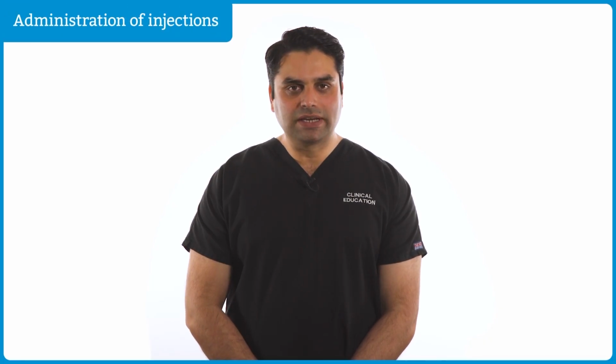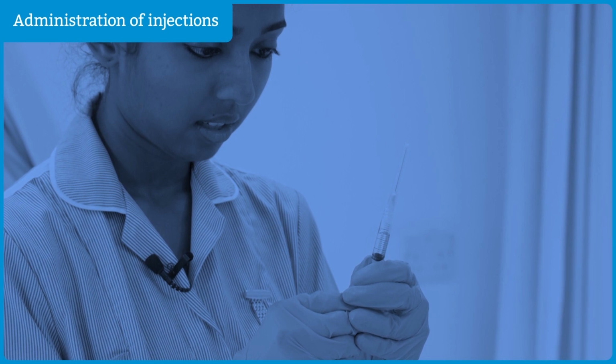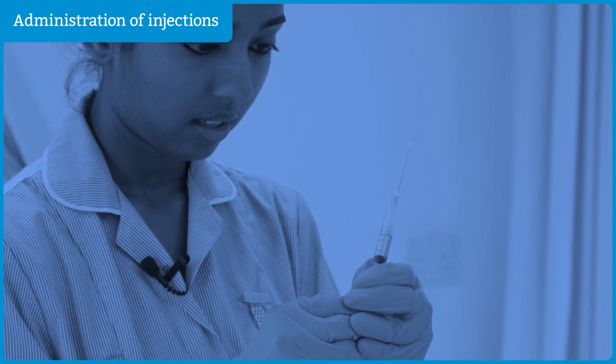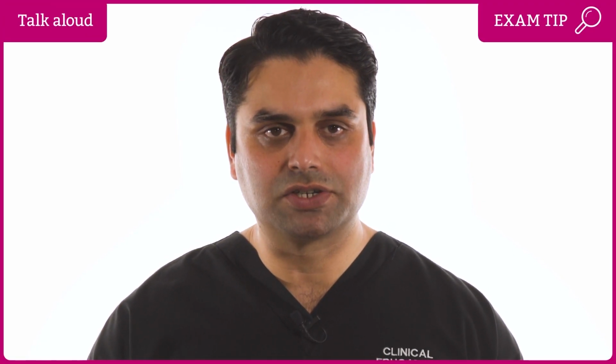There are a variety of clinical skills that nurses perform as part of their duties. In this video, we'll offer some best practice advice and guidance based on the Royal Marsden Manual for administration of intramuscular or subcutaneous injections. Speak aloud throughout to explain your actions even when not addressing the patient.